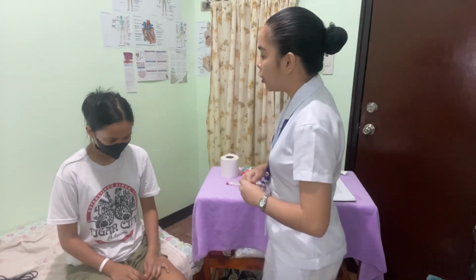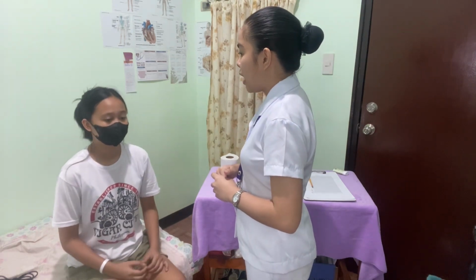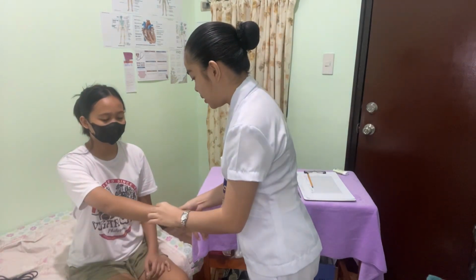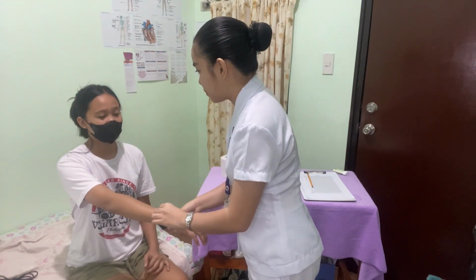So, good morning, ma'am. I am Nikka Andrea S. Pilas. So, today I'll be taking your blood pressure. Is that okay to you, ma'am? May I see your wristband? Please state your name. Your birthday, ma'am.